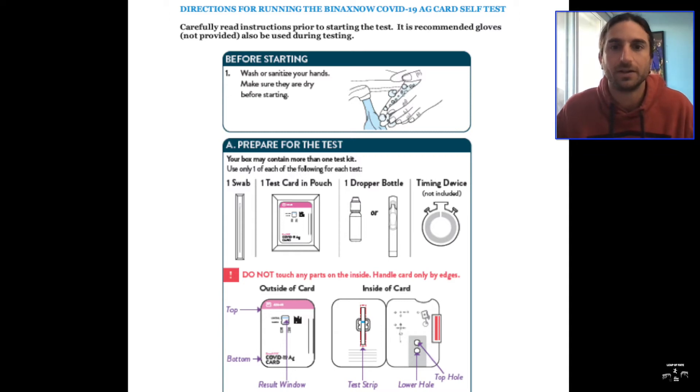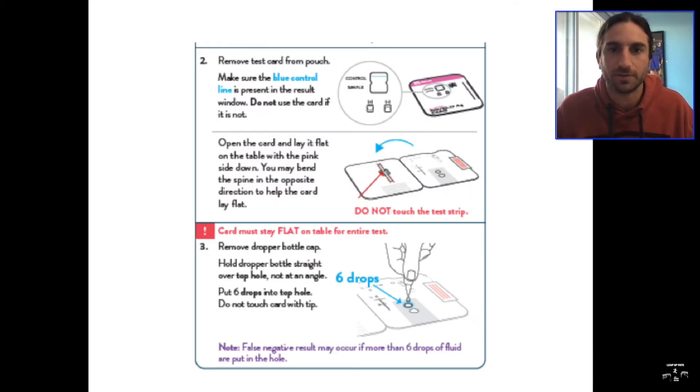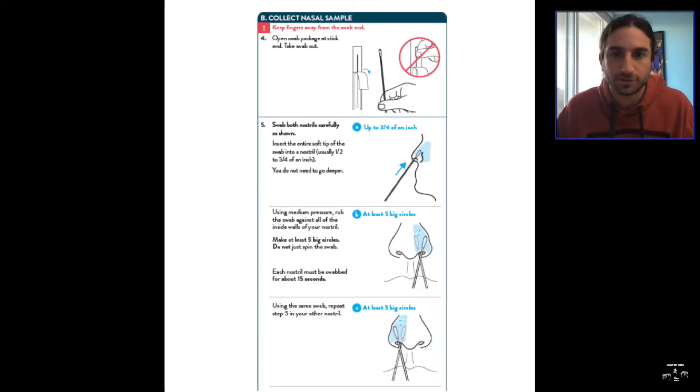The kit includes the card, the swab, and a timer — which can just be your phone. Make sure you follow the instructions to start, as this sets everything up inside the test packet. When you take your sample, it will then be able to read whether you are negative or positive. Then you go through and do the swab in your nose.